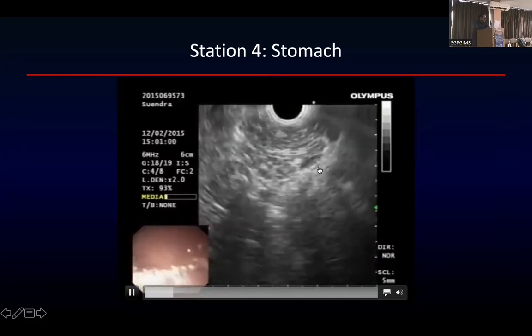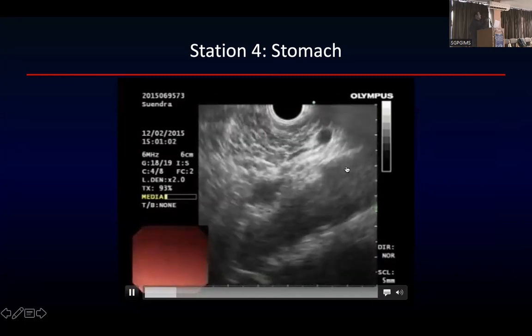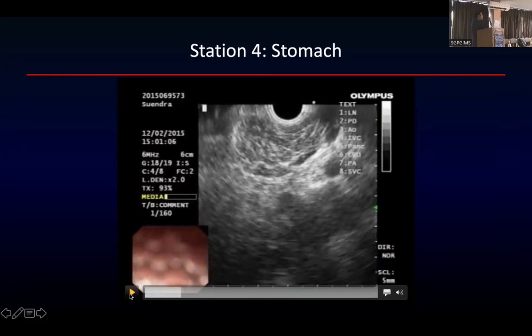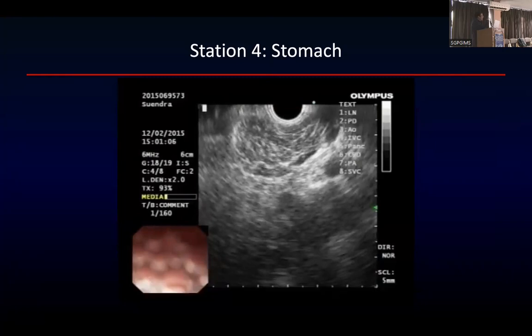And from this, the celiac is coming, and below the celiac comes the SMA. If you consider those two fingers, they are pointing towards the pancreas. So if you just push in your scope slightly, you will follow the pancreas. This pancreas is not a normal pancreas. The typical normal pancreas has a typical salt and pepper appearance.